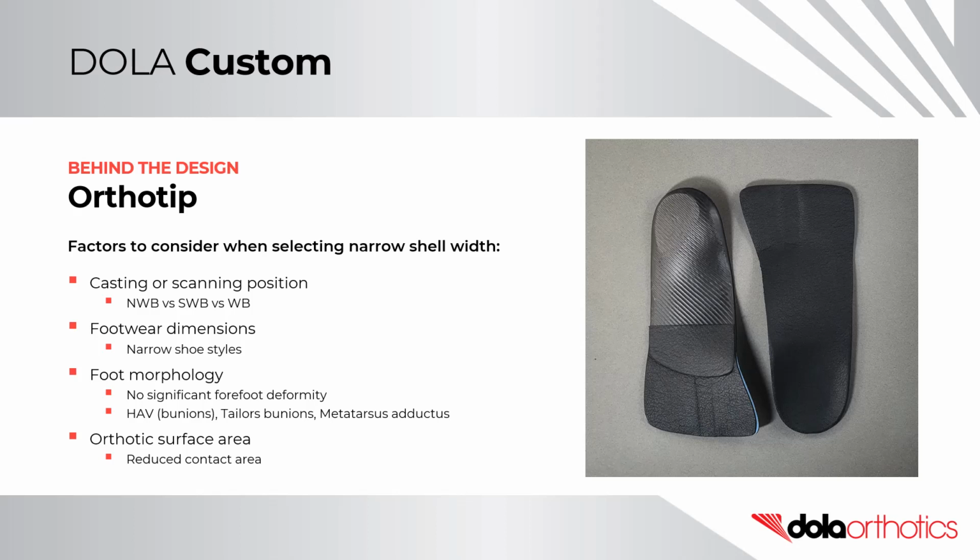And the orthotic surface area. This is reduced with a narrow shell width.